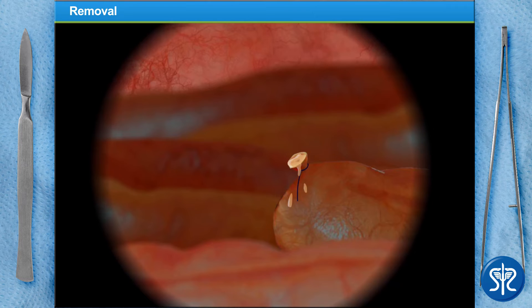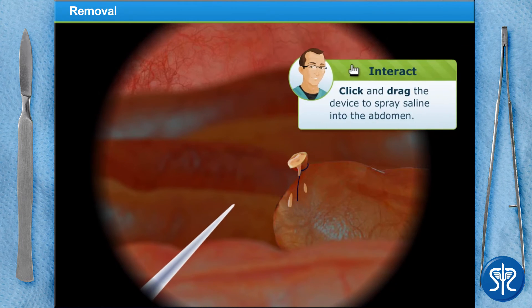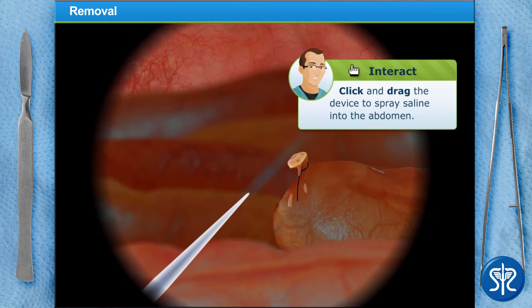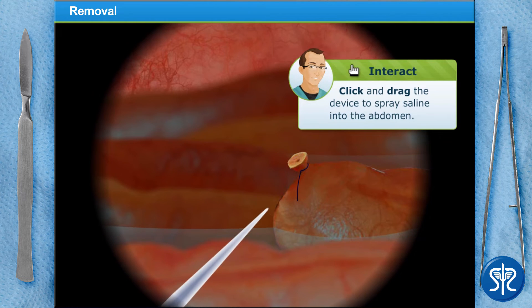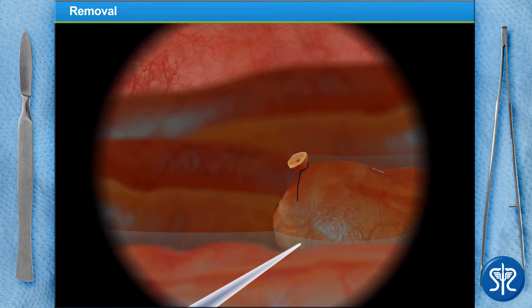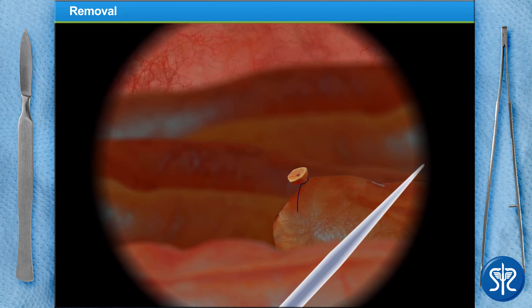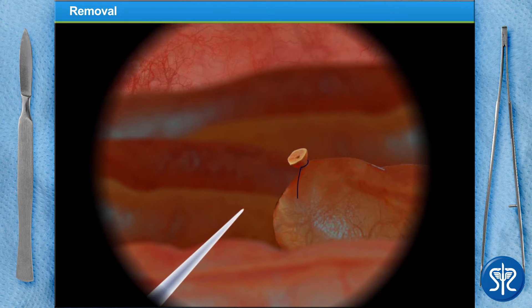Now onto the cleanup. We've inserted a device that sprays saline into the abdomen. Move it around so that everything gets sprayed clean. With a flick of a switch, our saline is suctioned back into the same device.